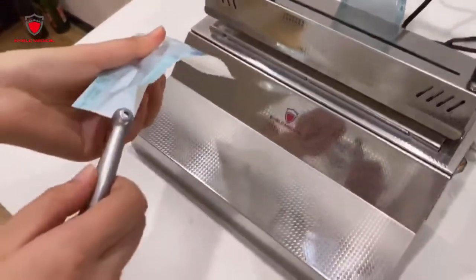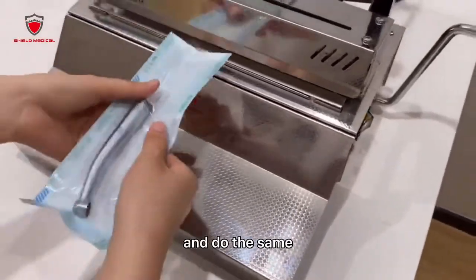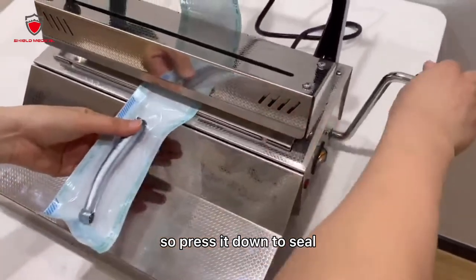Put the instrument into the sterilization pouch and do the same — press it down to seal.